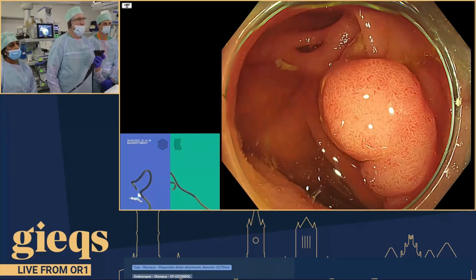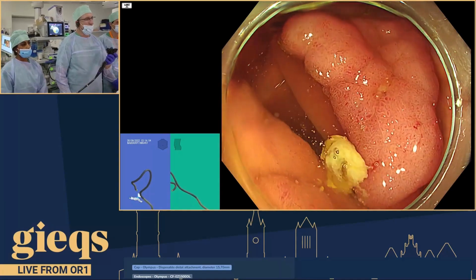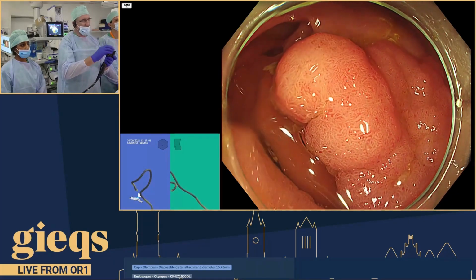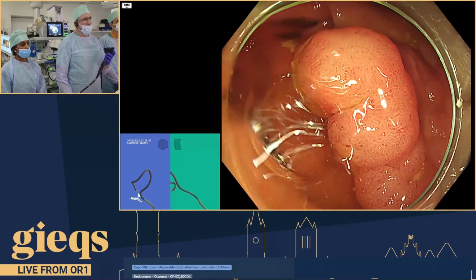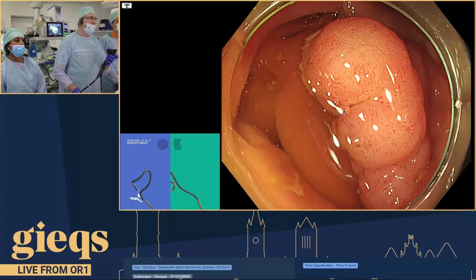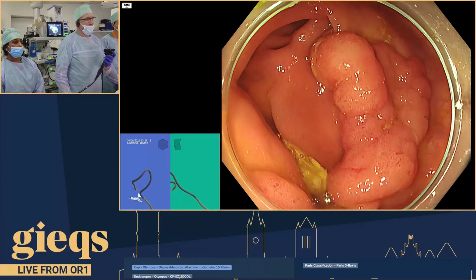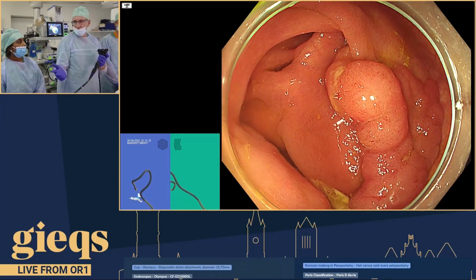Nothing to worry about. So it's a granular lesion, 2A morphology, sort of 2A1S really. It's on the cusp for cold. You know, it's a bit chunky to be done by cold, so it's going to be better to do it by hot. But we are near the end of a randomized trial of hot versus cold for polyps between 15 and 40, and flat polyps between 15 and 40. This is not really flat because of that nodule. So we just have the needle, thanks.